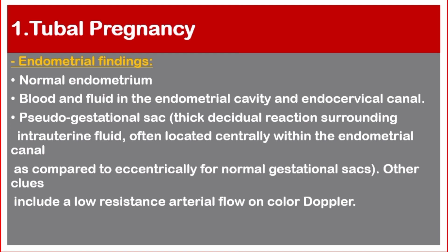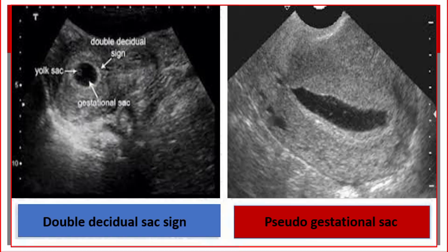Endometrial findings include either normal endometrium, blood and fluid in the endometrial cavity and endocervical canal, or a pseudo-gestational sac — a thick decidual reaction surrounding intra-uterine fluid, often located centrally within the endometrial canal, as compared to eccentrically for normal gestational sacs. Other clues include low resistance arterial flow on color Doppler.